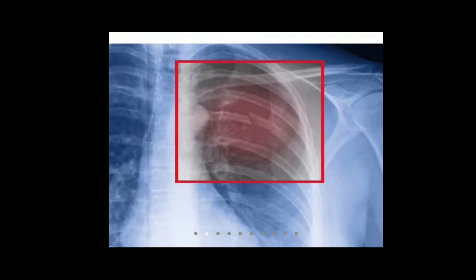Could anyone like to give the answer? Cause of tension pneumothorax. Trauma, sir, penetrating trauma, sir.